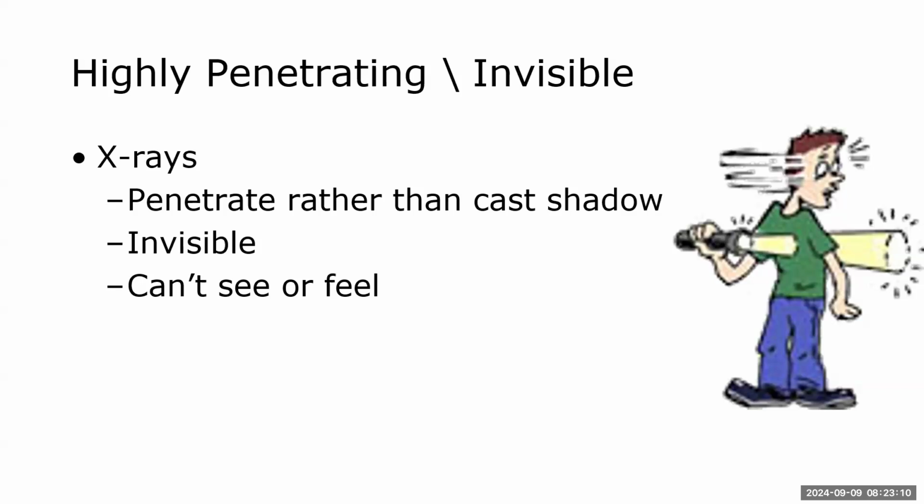If we used to do an example, we would go in one of our rooms that had no windows, close the door, turn the lights off, and open up an old CR cassette and irradiate it and let you see what would happen to that cassette when it was exposed. You can't see the X-rays themselves, but you can see the result of them interacting. It's just like the wind. You can't see the wind itself, but you can see the effects of the wind. It's the same thing with X-rays.